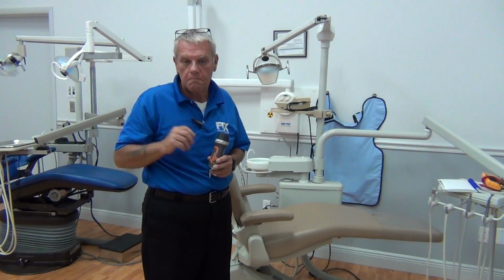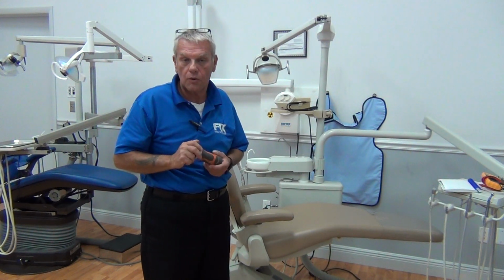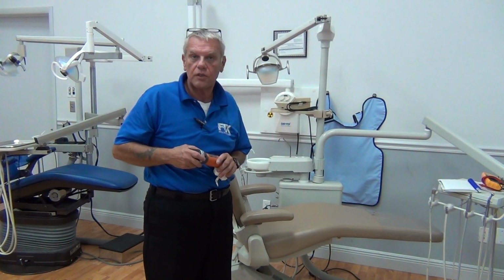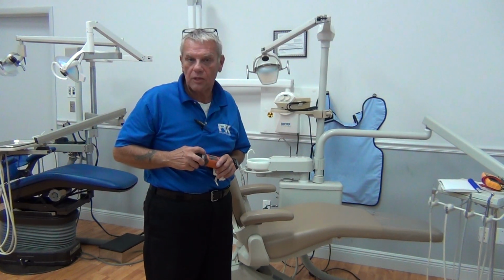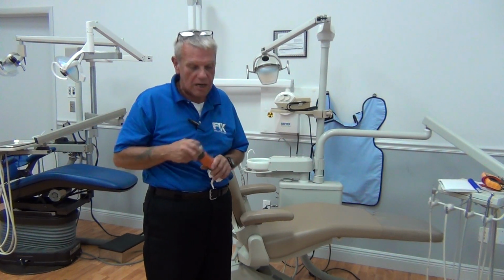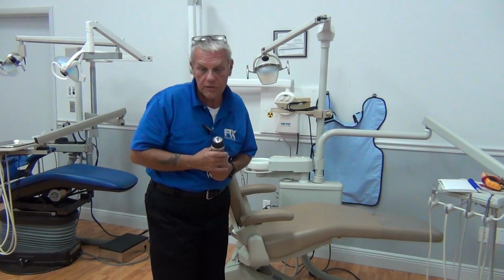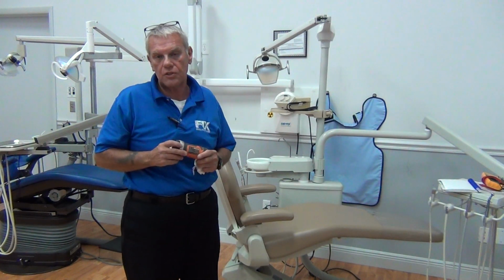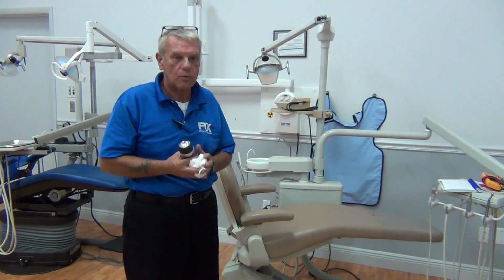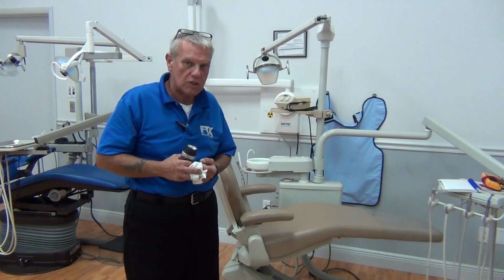Okay, doctor. I'll call the call center, the operations support center, or have one of the ladies call you, and we're going to schedule a service call for that. It can be quite involved. We'll be happy to set and customize your switches and your automatic position to your leg length and also to your assistant's specs. Always show that you're willing to go the extra mile resultant from the maintenance. And follow up on the suggestions you make.